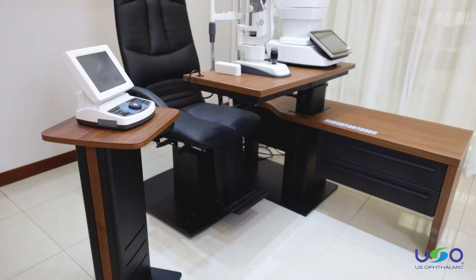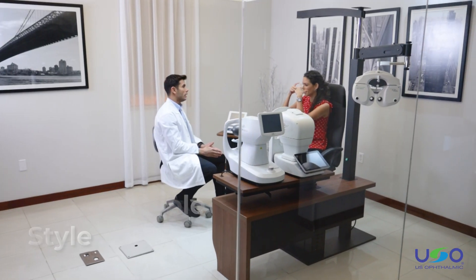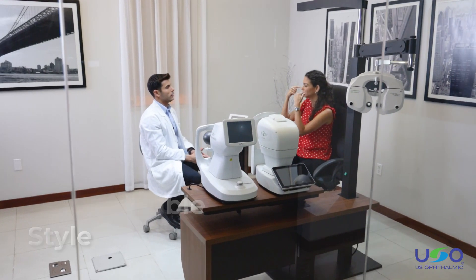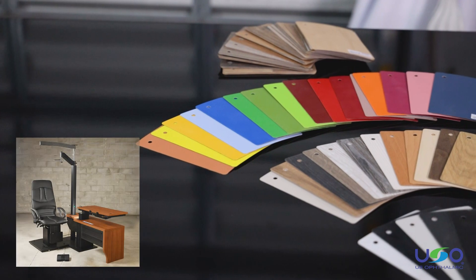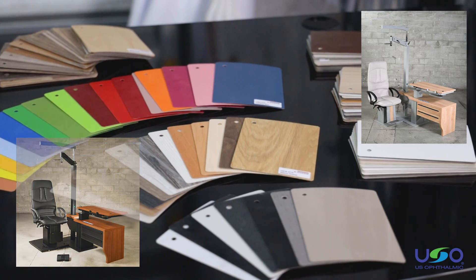Meet Venetia. This unit is an elegant upgrade from the classic design and brings a customizable style to your practice. The Venetia can be crafted with a wide selection of colors and materials, so your office creates a warm, comfortable feel for patients.